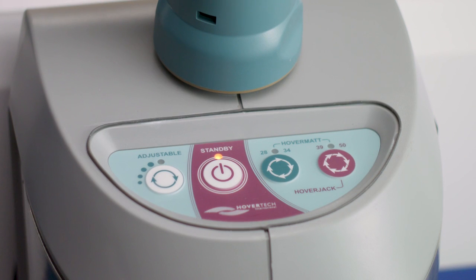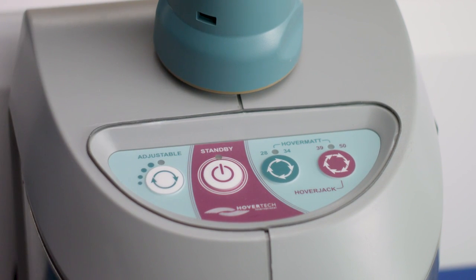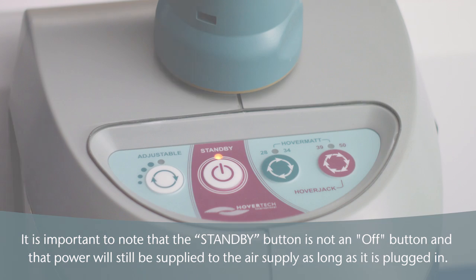The control button for the variable speed function is labeled adjustable. Each press of this button will incrementally increase the airflow and rate of inflation. To stop inflation of the Q2 Roller, press the standby button. Note that the standby button is not an off button and power will still be supplied to the air supply as long as it is plugged in.